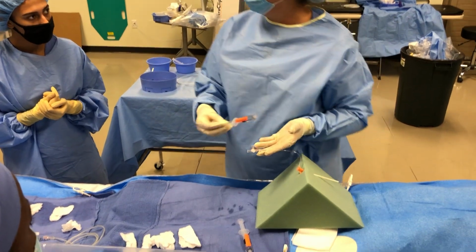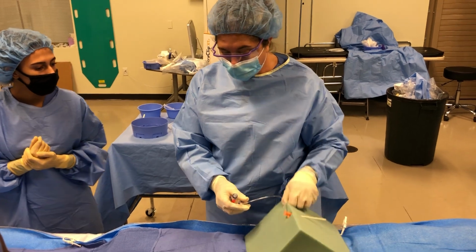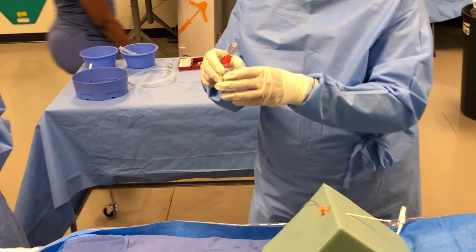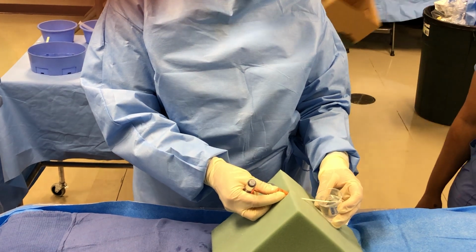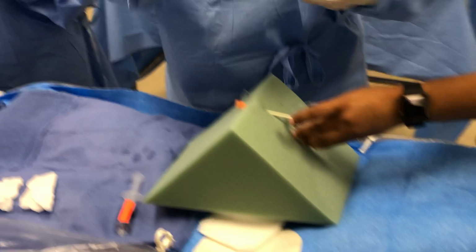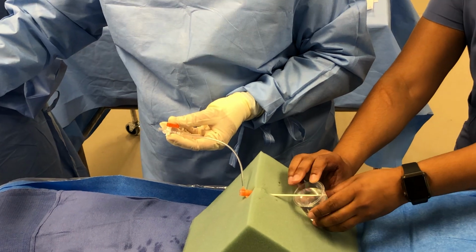But there may be a time that you actually have to flush the sheath. So you need to understand about flushing the sheath, okay? Tia, will you come up and just hold my cup in place for me? So that we can actually do fluid to fluid. I have to have her hold. I'm okay on this side. Just because it's this demonstration. She's not really here. This is in the artery. Forget she's here.